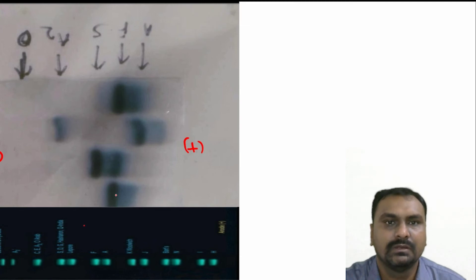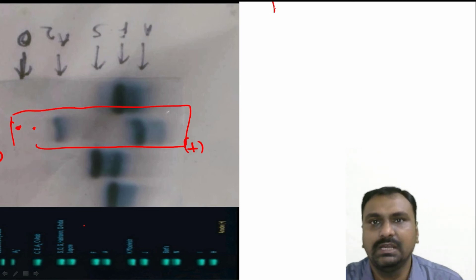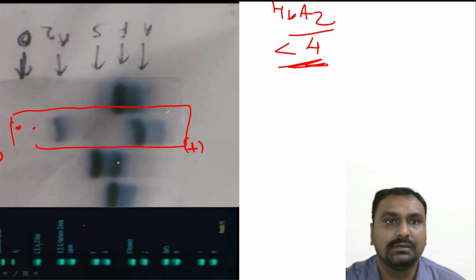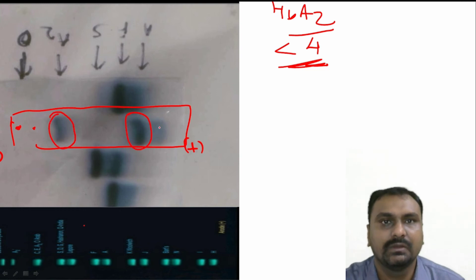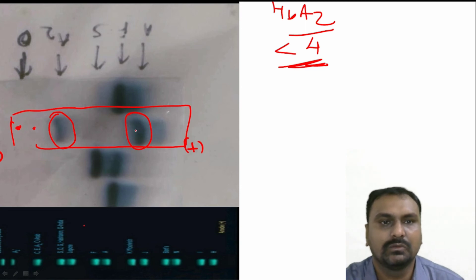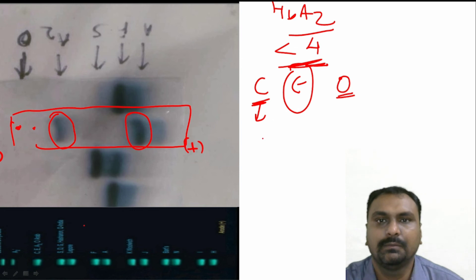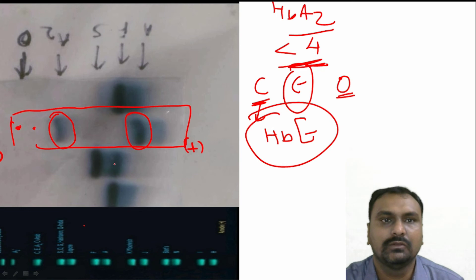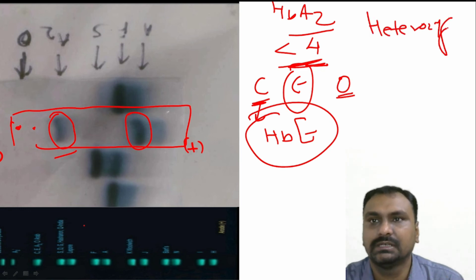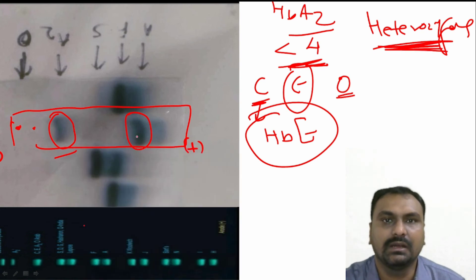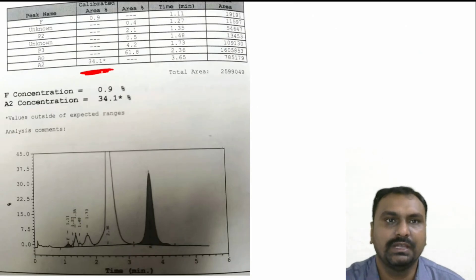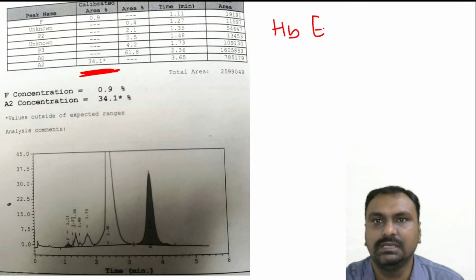Now you can appreciate this picture. There is a point of application, carbonic anhydrase, A2, and normal HbA2 is less than 4%. But here you can see a band with a percentage similar to HbA. At the A2 region, if there is such a prominent band, it can be either HbC, HbE, or HbO Arab. HbC is seen in Africans, HbO is in Arabs, and in Northeast India — West Bengal and Assam — HbE is very common. This is HbE heterozygous; the patient has mild anemia and microcytosis. That can be confirmed with HPLC; you can see HbA2 portion of 34%, which is mainly HbE heterozygous.